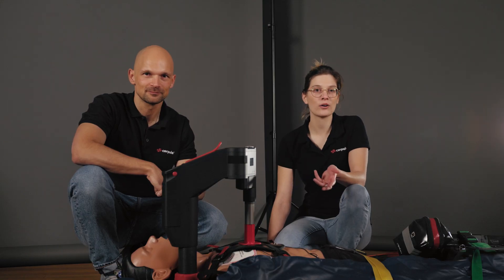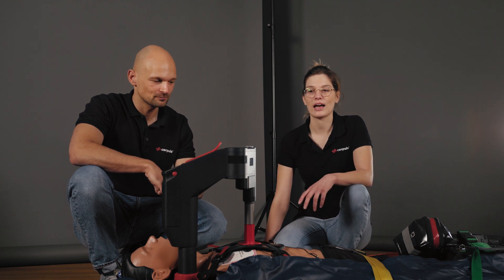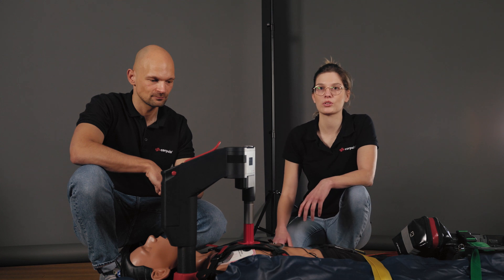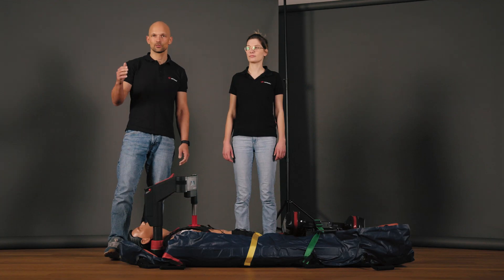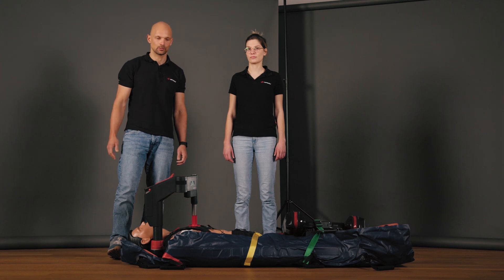We have opted for the vacuum mattress here because it is a really good option. On one hand, it provides the Corpus CPR with more support and prevents it from slipping. On the other hand, it's a great option for transfer to stretchers or other means of transport. We now want to show some movements representative of transport situations under ongoing CPR.